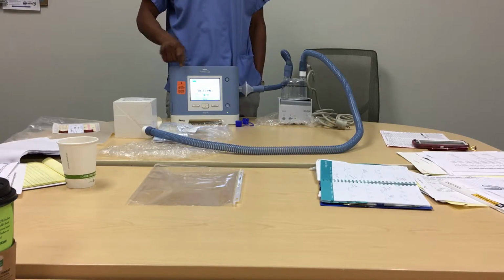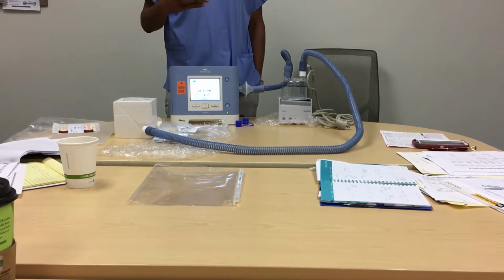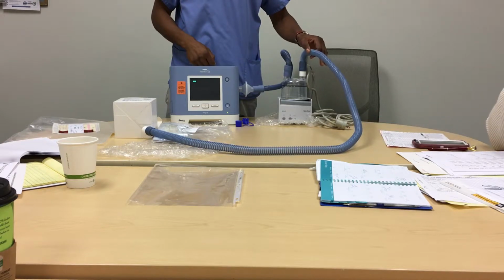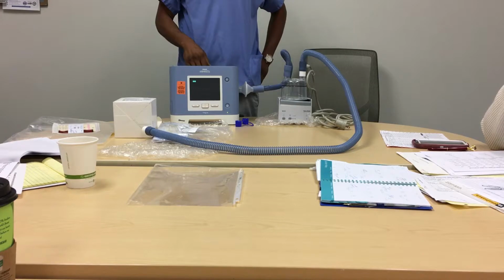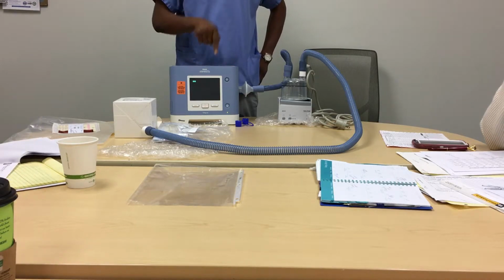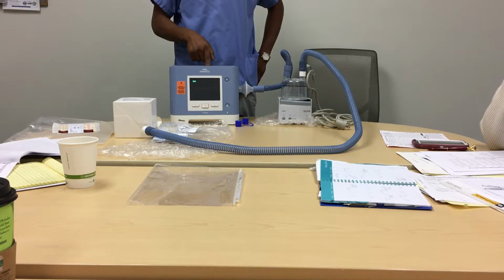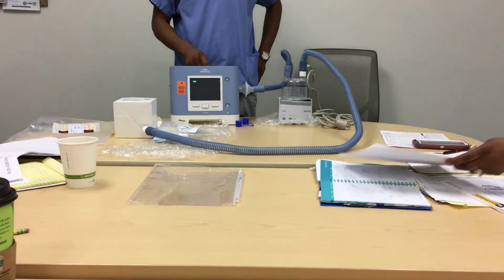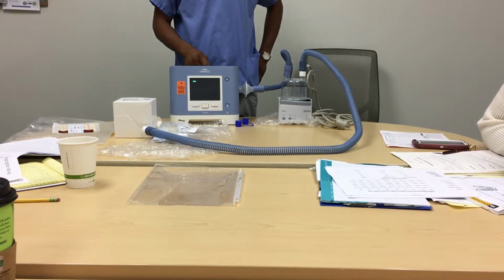Comparatively, if you look at this and the LTVs, the LTVs are tried and tested. The only problem, in my opinion, is the circuit, since it has that PEEP valve that you can literally dial in. It always gets clogged with moisture. You will not have that problem with this. Since we don't carry the LTV 950s anymore, patients that were transitioned from that to this tolerated this a lot better than the 950s. Now, if you look at the ResMed Astral, the Astral is good, but it still has a lot of work to be done on it because it's really very technical.